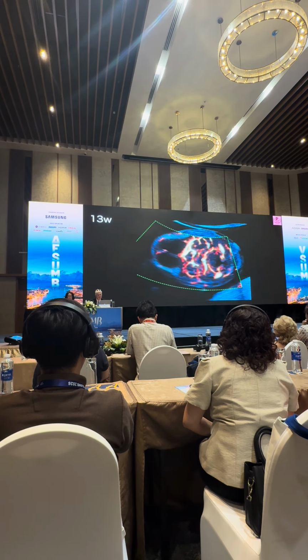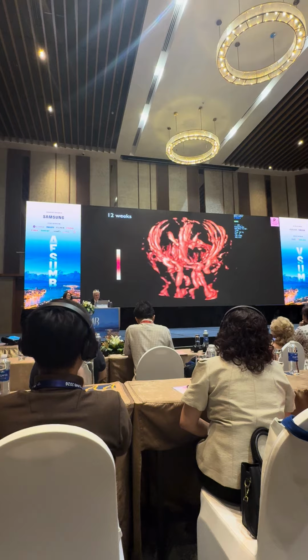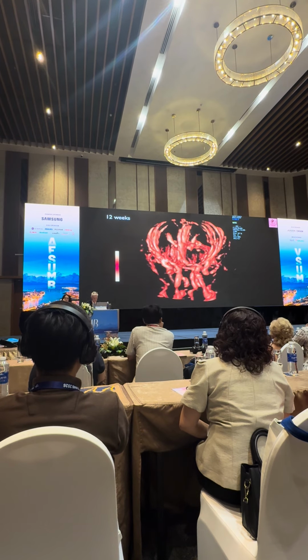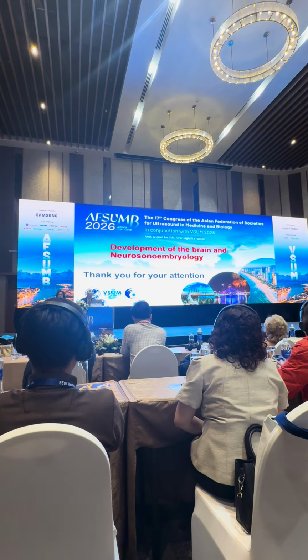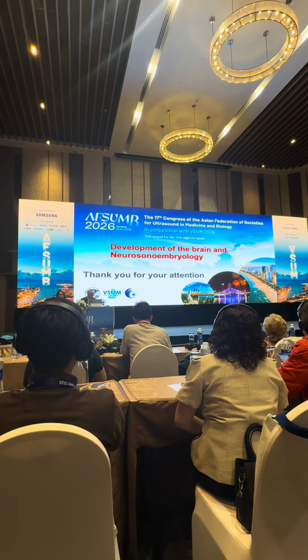So I think nowadays, because of transvaginal neurosonography, we can see many of the normal and abnormal development of the brain. Thank you very much.